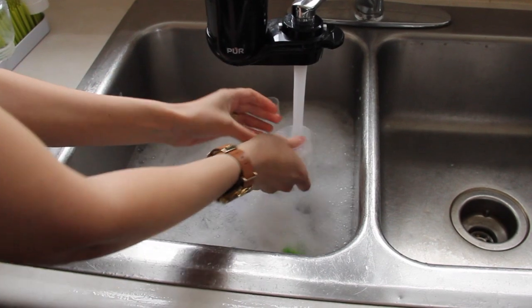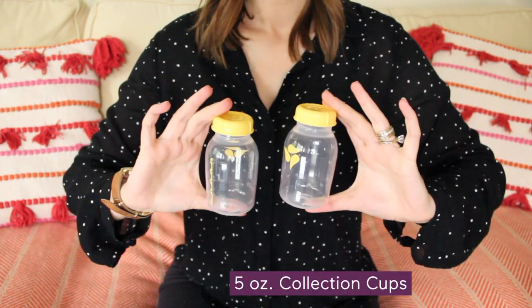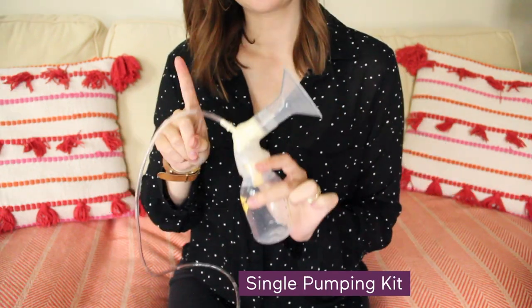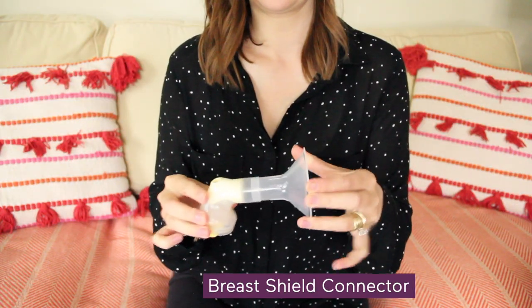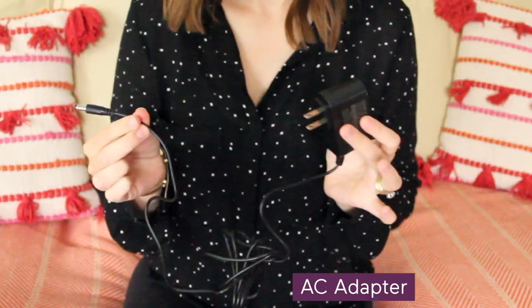Just know that you'll need to take extra care while cleaning the parts post-pump. The Swing comes with two 5-ounce breast milk collection cups with lids, a single pumping kit including one 24 millimeter flange, connector, the valve, and white membrane, and an AC adapter.